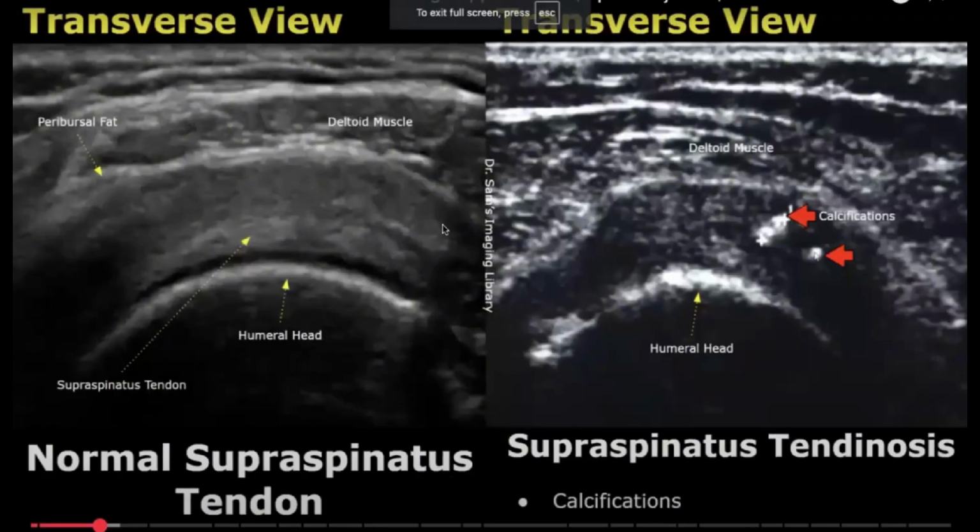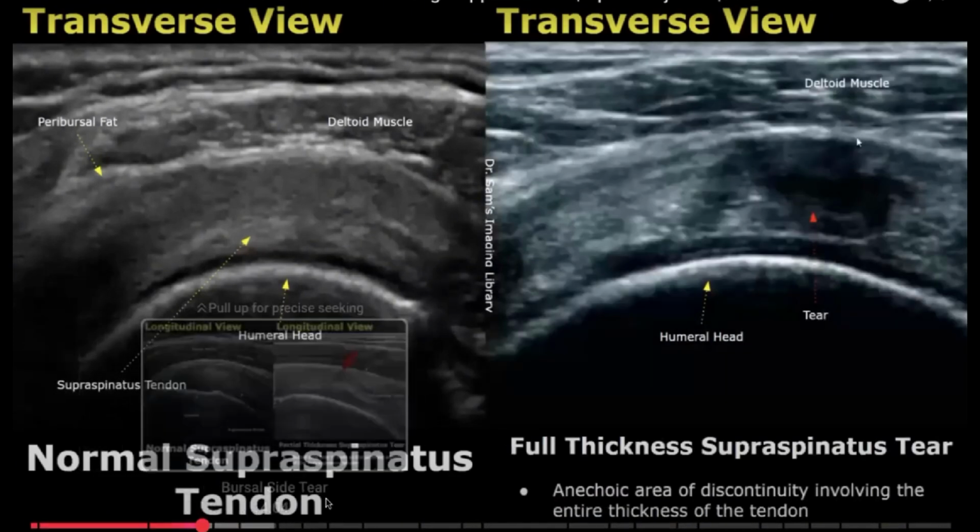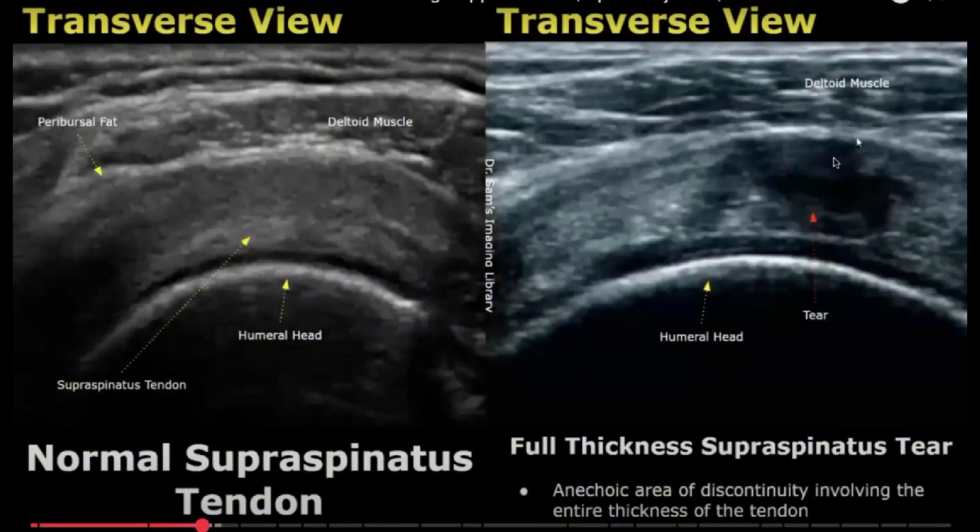Look here, please. You should see this hyperechogenesis. By the way, there are some tendinosis here, in my opinion. But you should see all the tendon like this, hyperechoic, no hypoechogenicity, and you should see fibrillar pattern, fibers parallel to each other. Very characteristic, my colleagues. See here, normal hyperechoic and a little bit fibrillar.